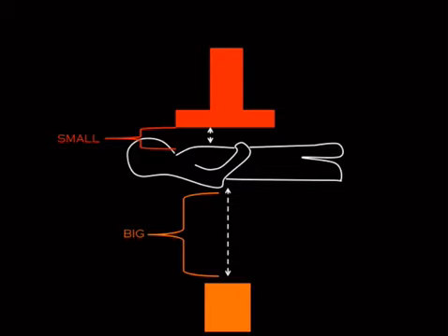All right, so the distance between the tube and the patient is the main thing that's going to decrease the dose, right? And it's not going to decrease it by half. It's going to decrease it by a factor of 4 because of that inverse square law that I keep bringing up.